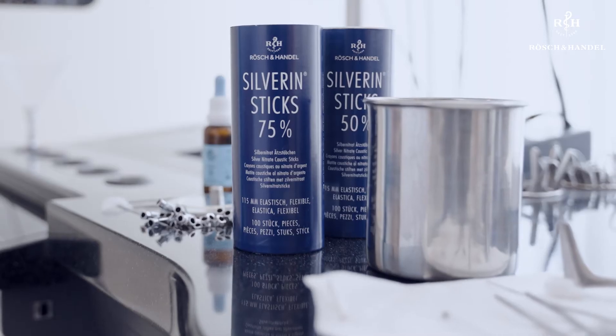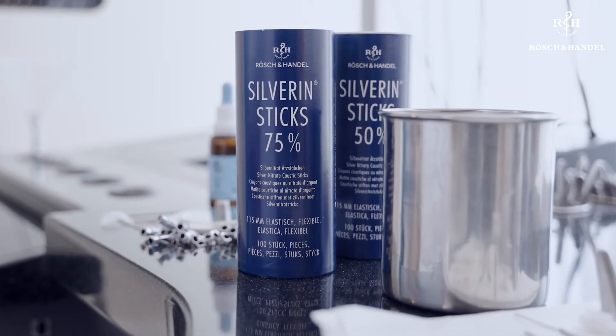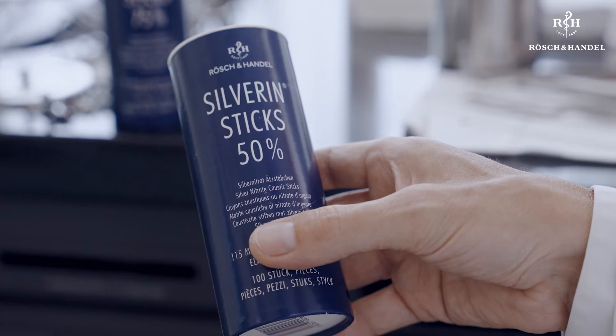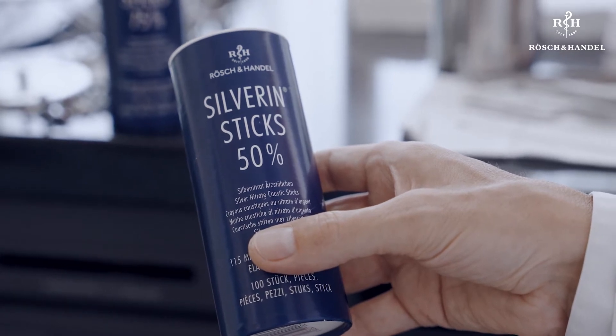In such cases, Silverin silver nitrate sticks are an ideal treatment option. These caustic sticks are very simple to use and complications are unlikely if certain basic rules are followed. Always only treat one side at a time and wait four weeks before starting with the second nostril. With children, only the 50% Silverin sticks should be used. For adults, the 75% sticks are more suitable.